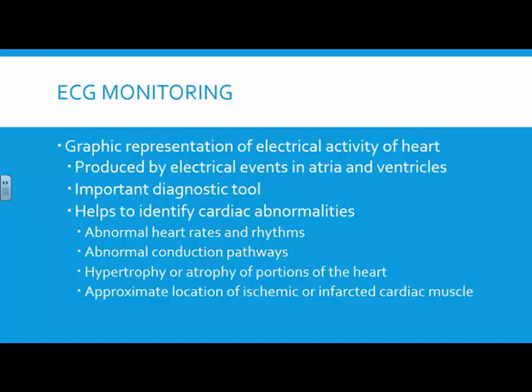Your ECG is an important diagnostic tool, but your most important diagnostic tool is your assessment of that patient, of what you're seeing with your patient. I have a saying that I say a lot and that you'll hear other folks say a lot. It's not 100% true, but it holds pretty steady: treat the patient and not the monitor. We're treating the patient, not a machine. That machine, though, is going to give us very important information to help us aid in the treatment of that patient. It is a diagnostic tool. It does not take the place of our assessment. It just helps.